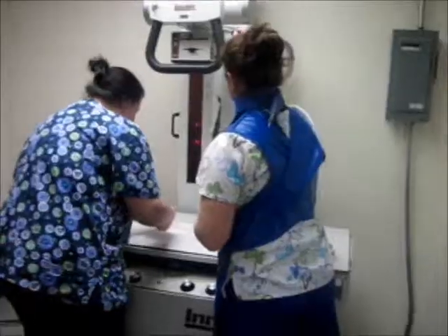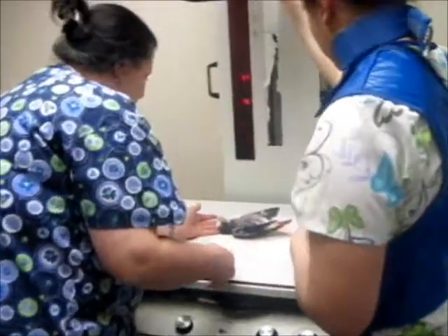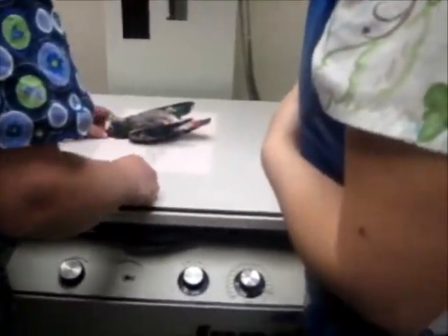Measuring thickness is not recommended for settings, so you should look up and go according to what the settings are for that type of bird that you are working on.